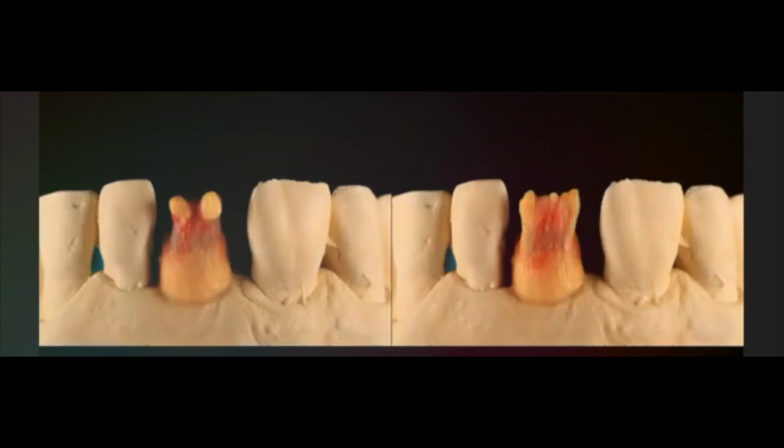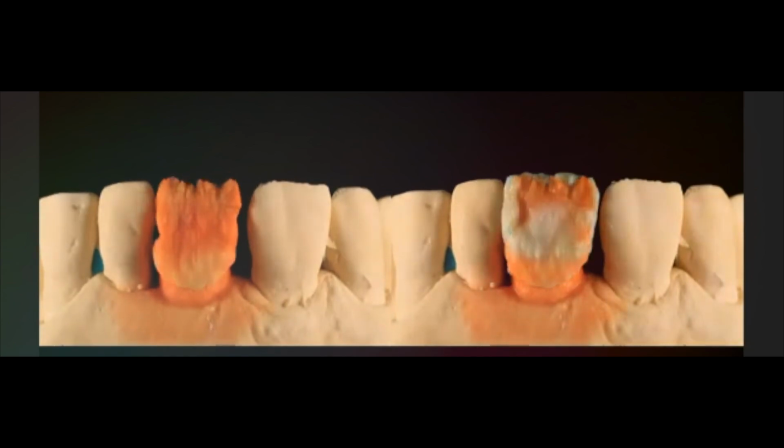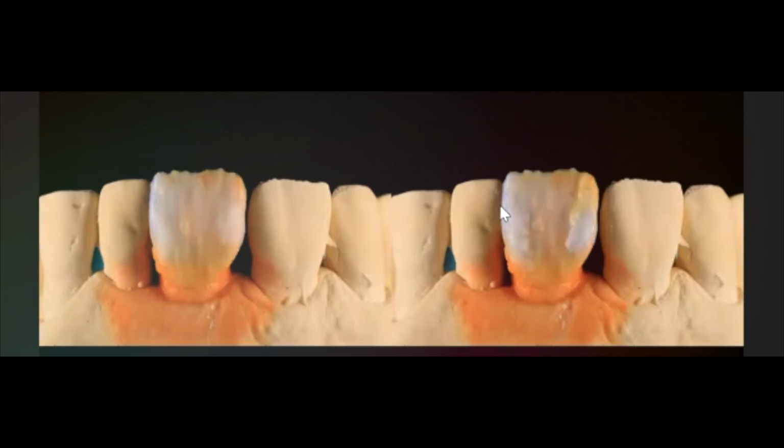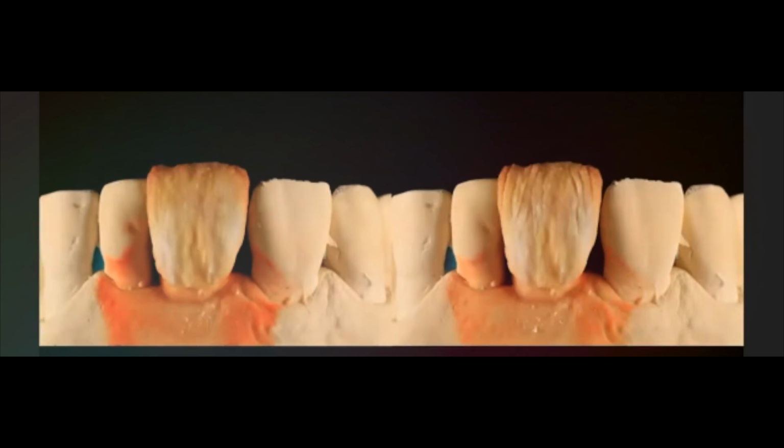We apply also cervical to the line angles, and then dentine, cervical translucent, cut back details with some opalescence materials, mamelons, more violet gray distal, and then we cover everything with pure transparent TX. Some internal cracks, and then some externally more thin and smaller.